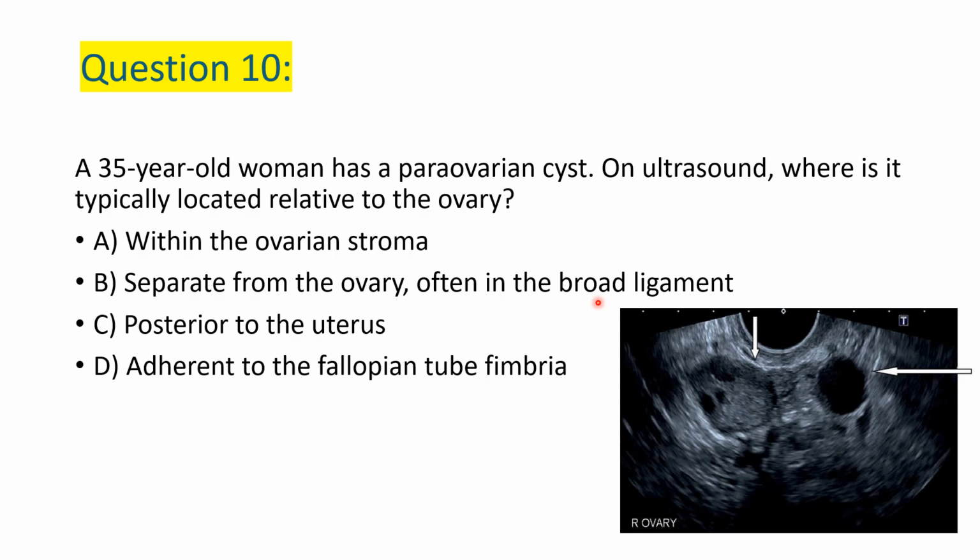So ladies and gentlemen, this is the end of our quiz presentation. These are the answers. Congratulations to all those who got the answers correct. To those who missed, I think this is your chance to learn. Add every pathology to your vocabulary of learning to improve your practice.